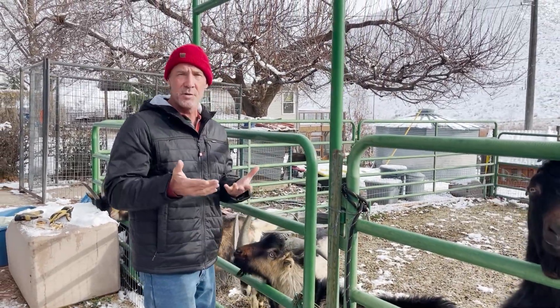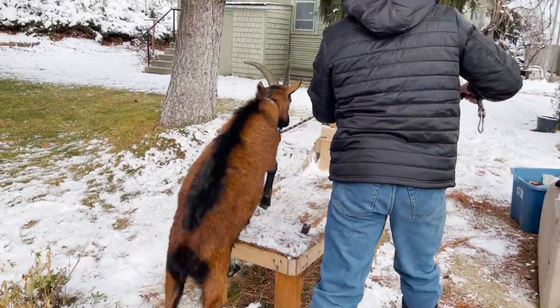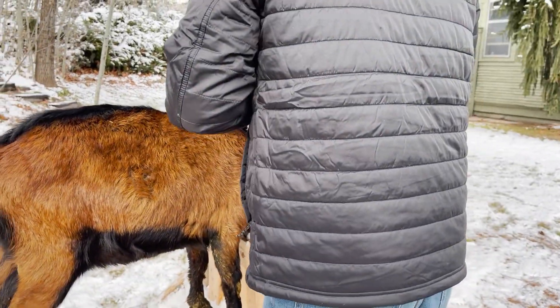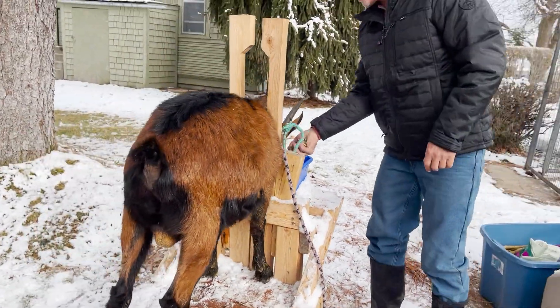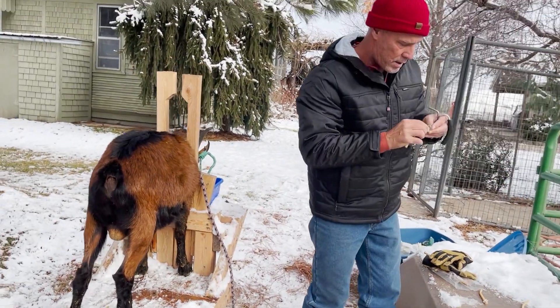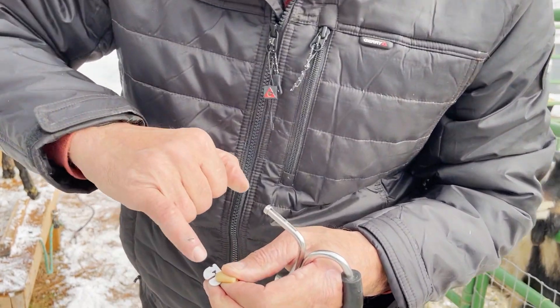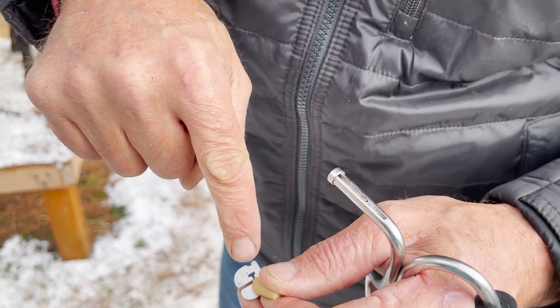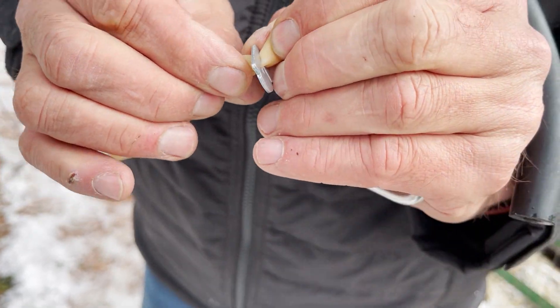I wanted to show you this little place right here — that's where the band goes in. You go in and then you pull it into this little catch right there. That's where it's actually arriving at, inside of the band. Just wanted to show you that.